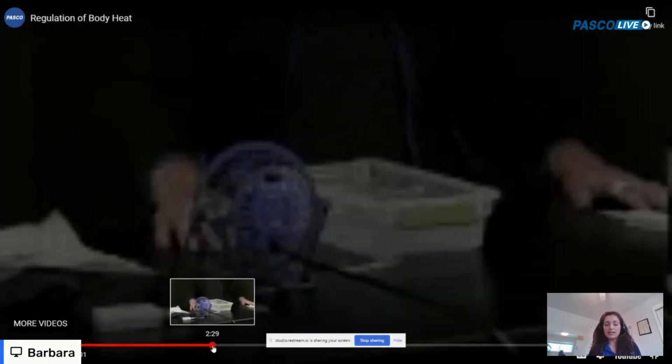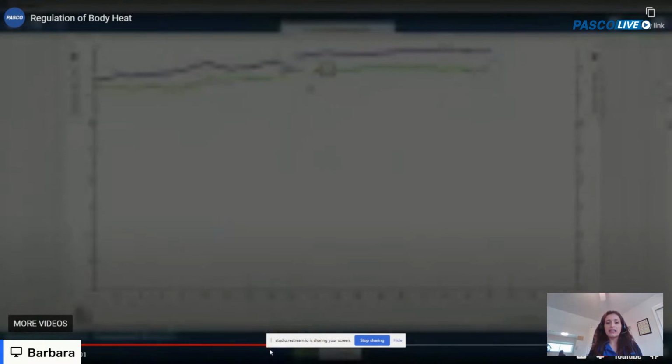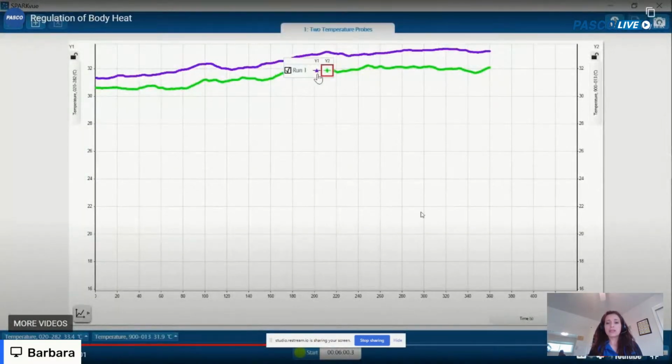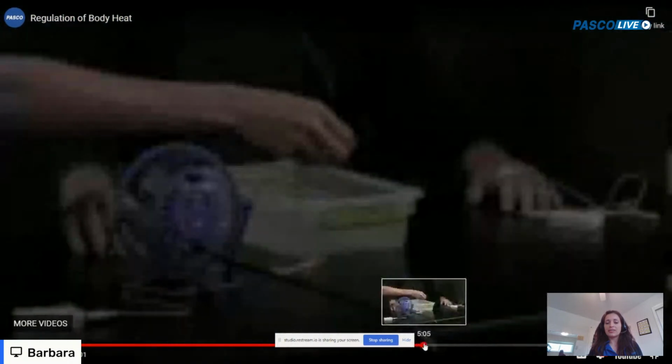We look to see how the body maintains homeostasis when part of the body is exposed to an extreme stress, like being in ice water, a major temperature change that could be deadly. That's the setup you see here. I'm going to speed through to where we're setting up the sensors on her hand, and this is where we're getting the background data. What is the normal temperature on each side? Then we're going to expose her to the stress of too cold a temperature and see what happens.